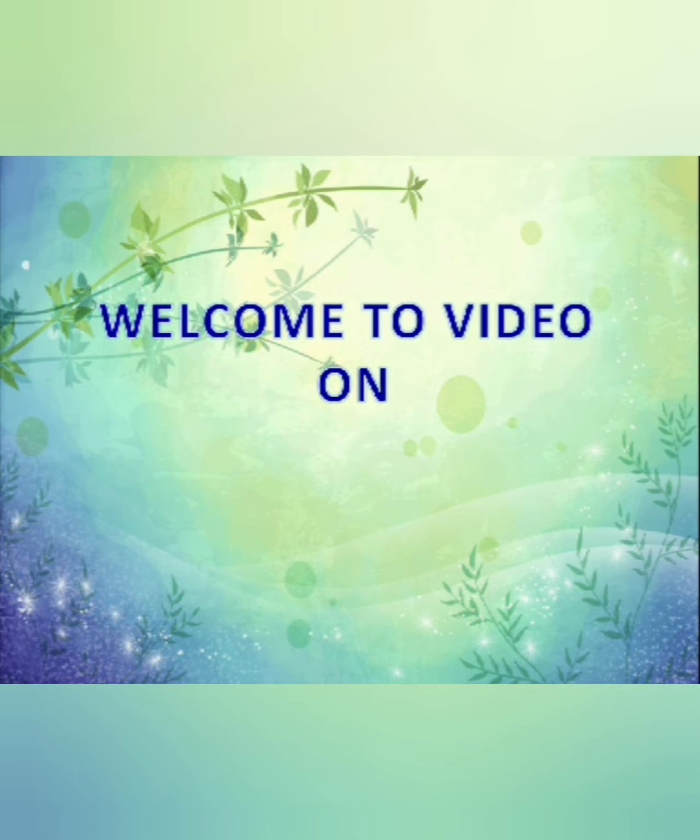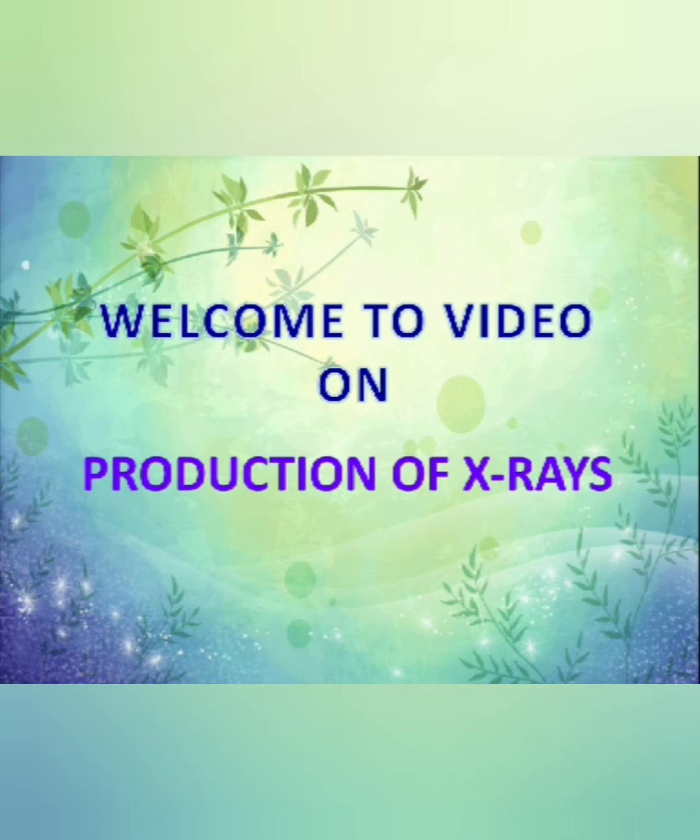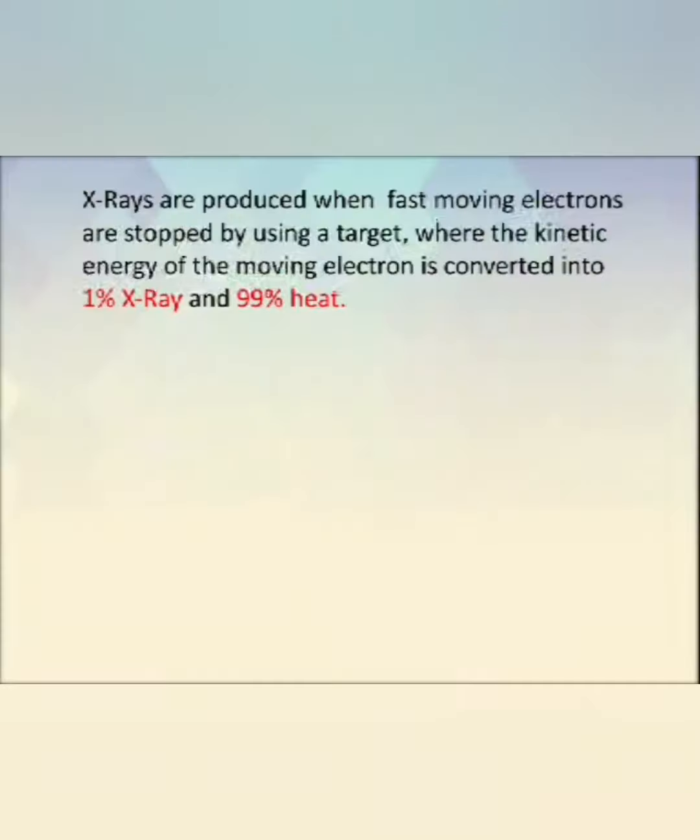In this video, we will be discussing the production of X-rays. How X-rays are produced. X-rays are produced when fast-moving electrons are stopped with the help of a target. When the electrons are stopped by using a target, the kinetic energy of the moving electron is converted into 1% of X-ray and 99% of heat.